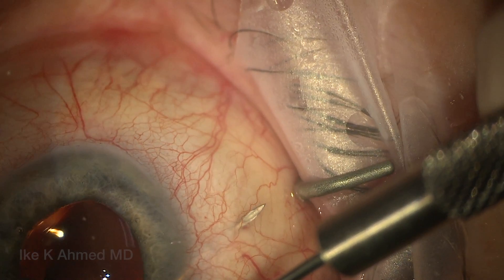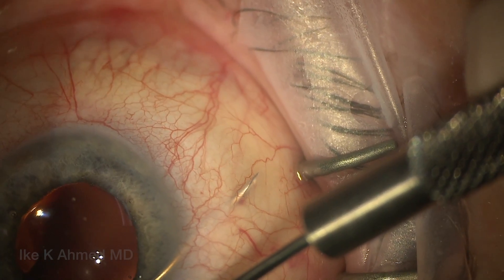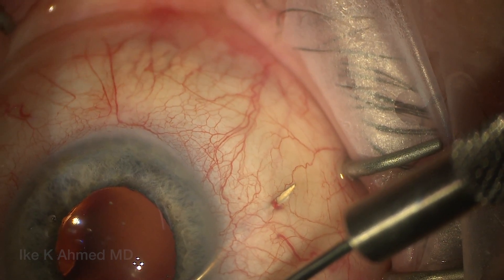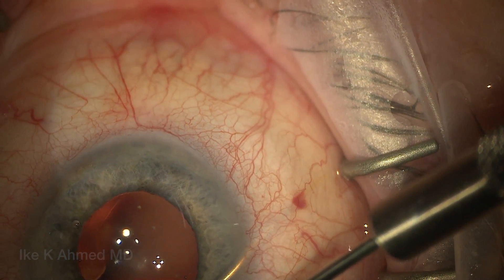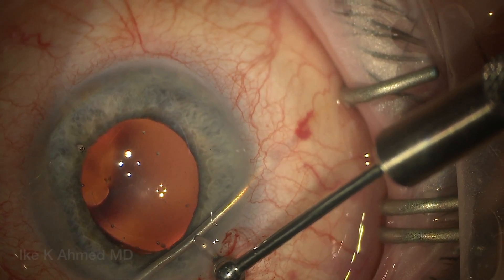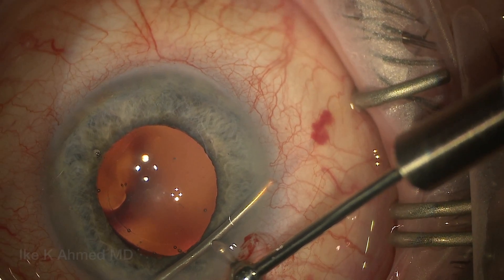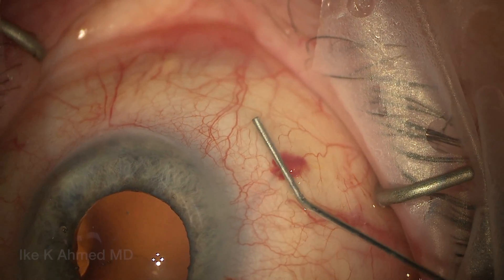It really doesn't perforate because we have the tissue on expansion with the mitomycin. Look how clear the needle is shown under the conjunctiva. I really want to get that needle through tenons just under conjunctiva, pushing up superficially, rotating the needle to really get it tenting up the conjunctiva — so I know I'm through tenons and away from any deep tenons placement. The deployment slider is passed forward and the needle retracted into the cannula after the implant is passed forward. Once the needle is into the cannula, we relax our hand, take a pause, and then pull back without flicking the cannula to avoid retraction of the device into the eye.